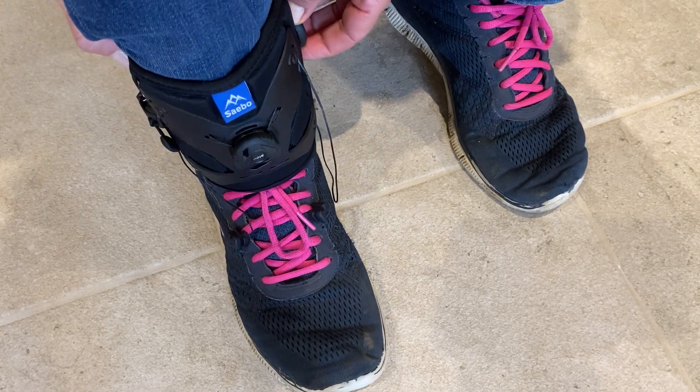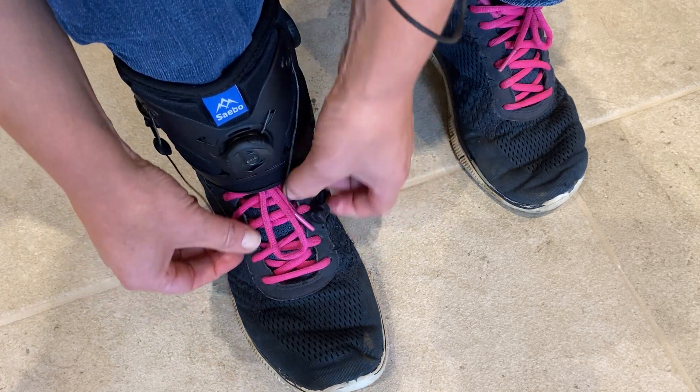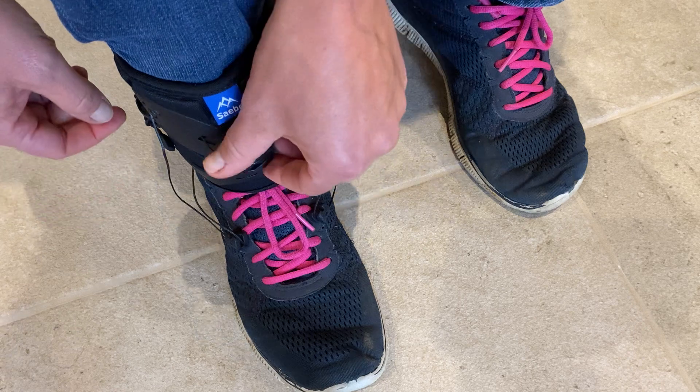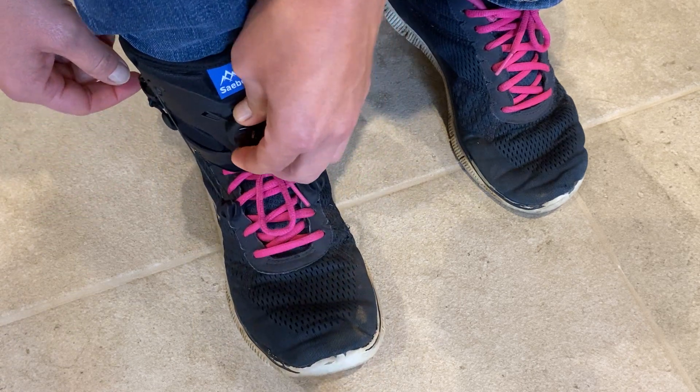Tighten up the dial to tighten my cuff at the back, then take the cords, put them into the eyelets at the front, and tighten up.